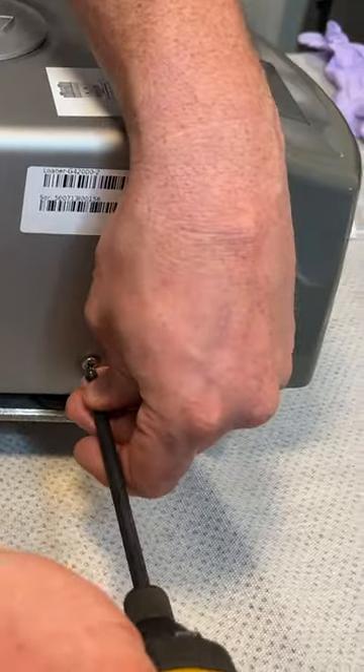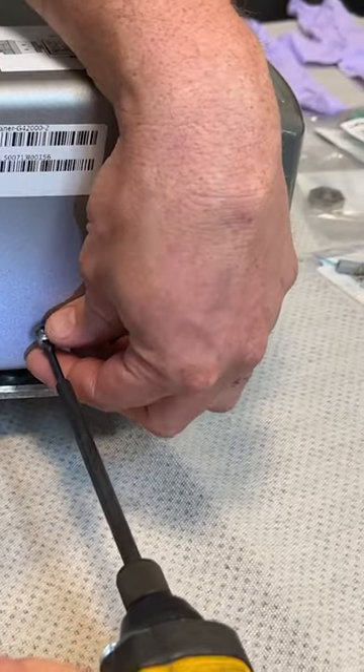There are seven screws that hold this top cover on. You have two on either side and three on the back. These should be all Phillips head screws.